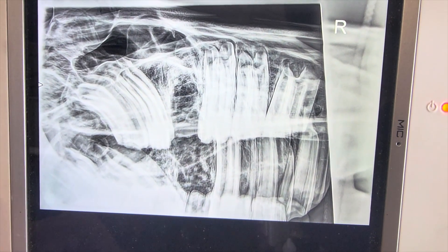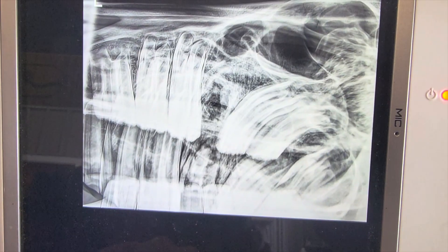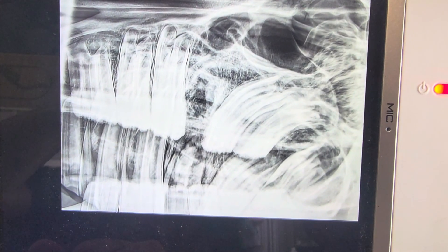We took that tooth out — that's the 109 on the right side — and we were able to get it out orally. On the left side you can see we were able to get all of that tooth out as well. We were able to do all of this using minimally invasive techniques, everything through the mouth with the horse standing. That took about an hour per side. We don't typically do both sides the same day, but this horse was rescued and it was a big endeavor to bring them all the way here, so we maximized their time and resources to take care of everything at once. Fortunately we now have really good techniques and instruments to do that in a minimally invasive way, and the horse should do well.